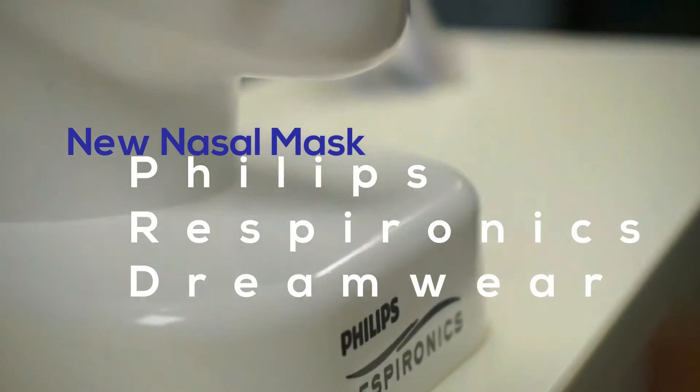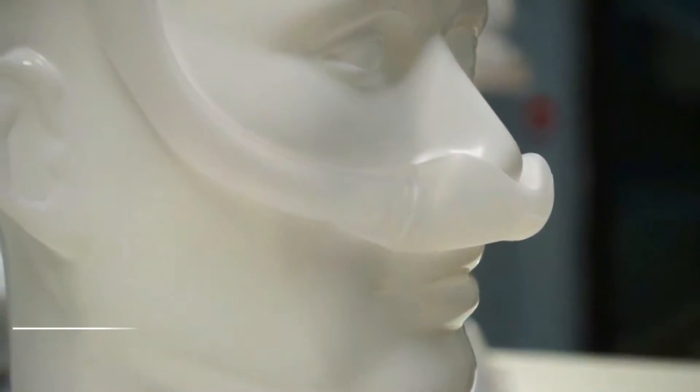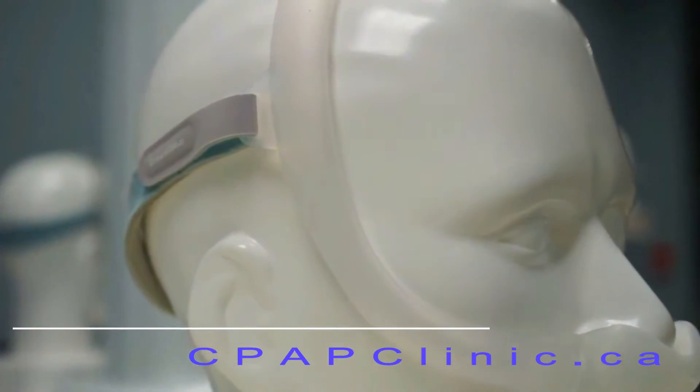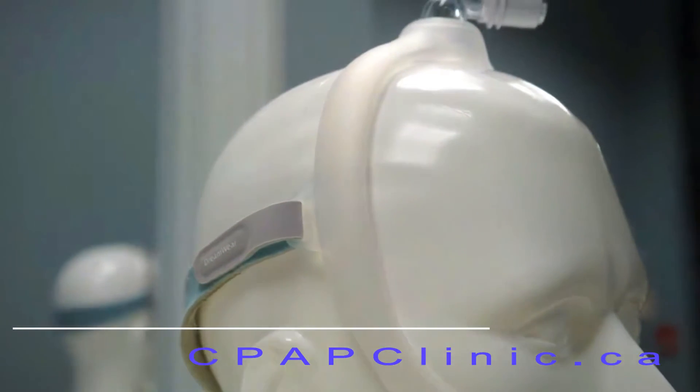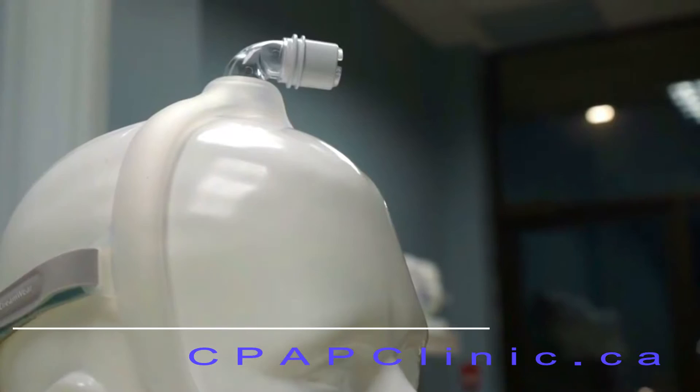The new Philips Respironics Dreamwear Mask, featuring a simple design with two head straps: one to the back of the head that's adjustable, and one to the top of the head which is non-adjustable but comes in various sizes.